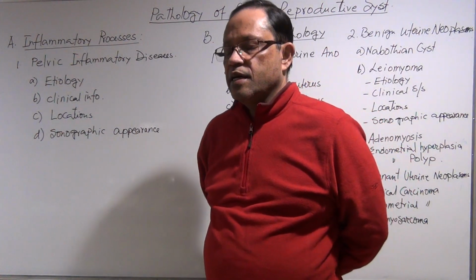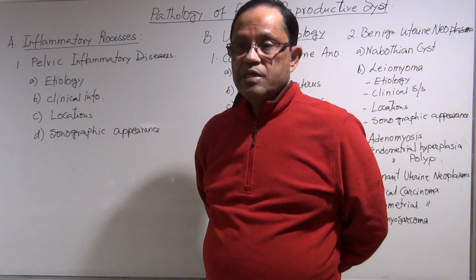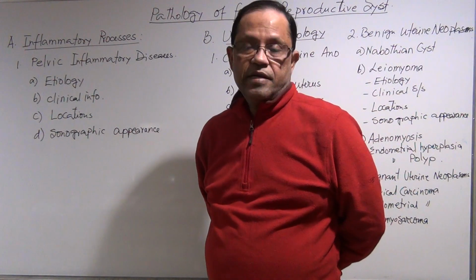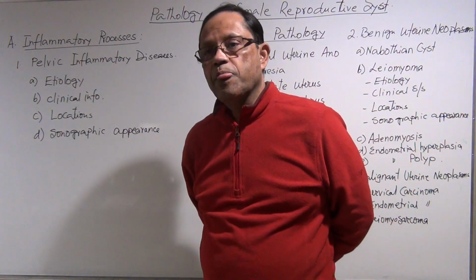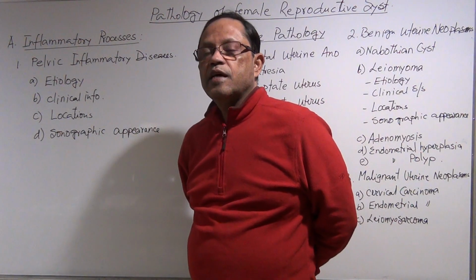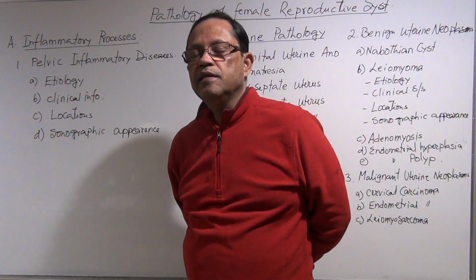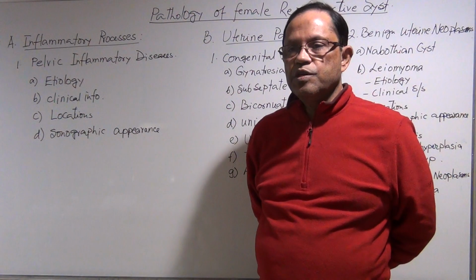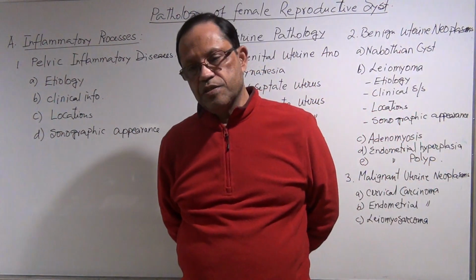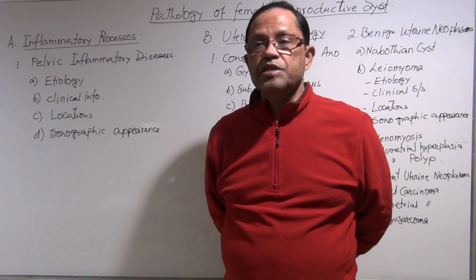Then I discussed the clinical signs and symptoms of some diseases, and the techniques applied for pelvic examination, all methods: trans-abdominal, trans-vaginal, trans-labial, even trans-rectal, and all the preparations, precautions, patient positions, transducer selections, orientation of the trans-vaginal examinations, and indications of ultrasonography.